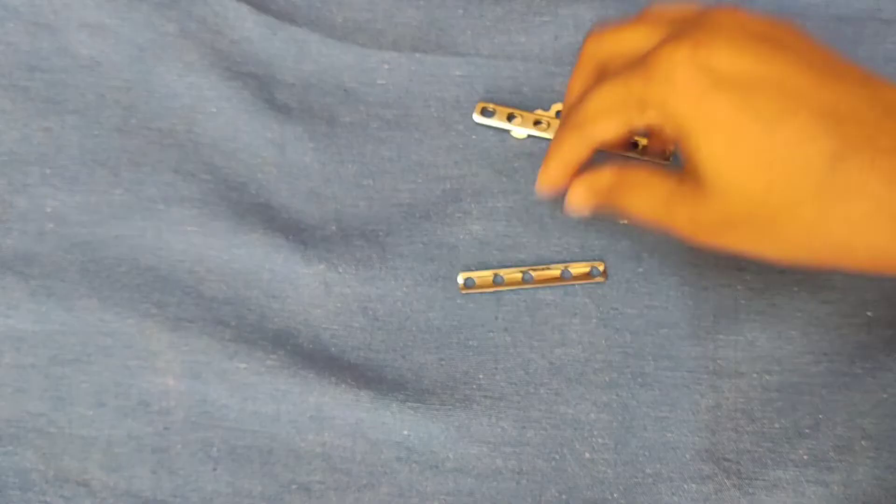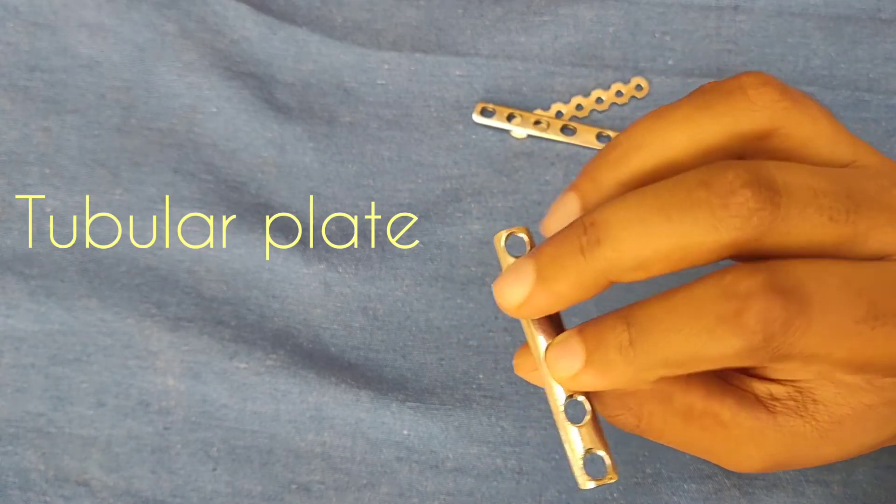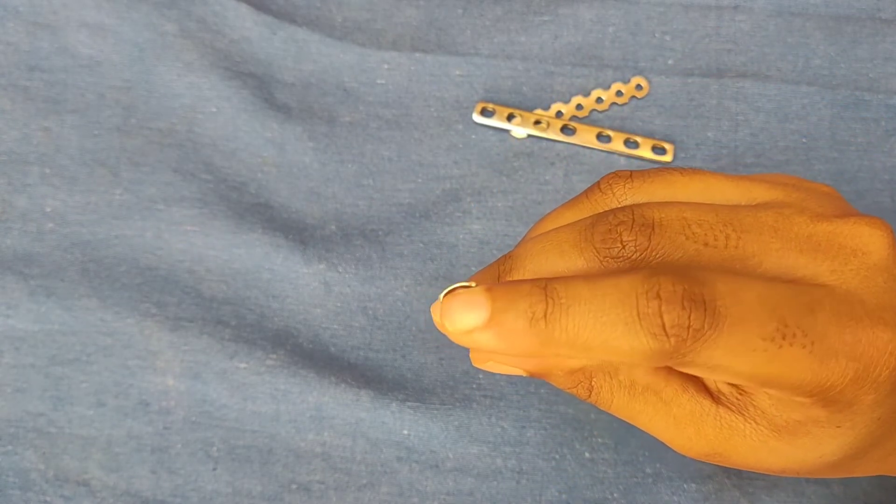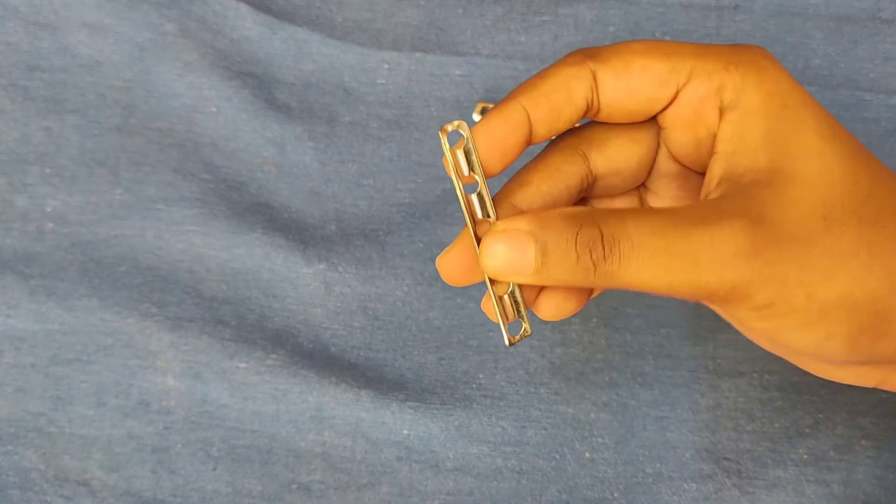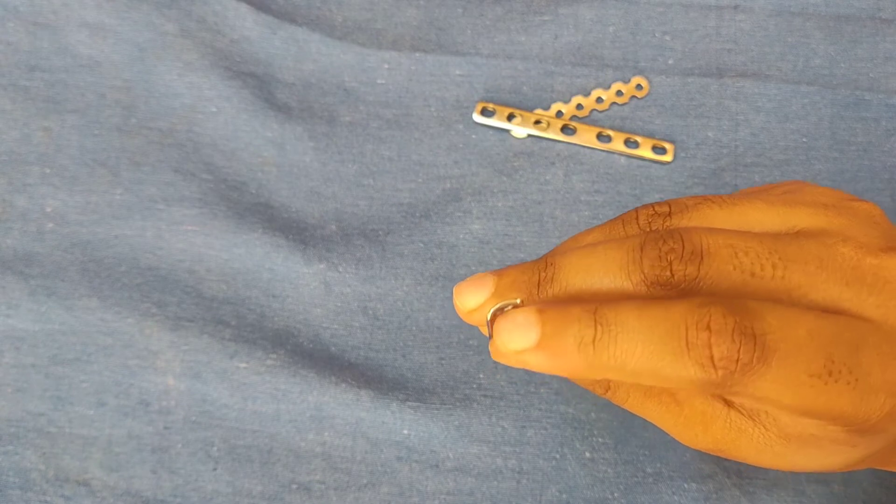Next is tubular plates. Tubular plates are actually part of a metallic cylindrical tube. It is mainly used in bridging and neutralization mode of plating. There are quarter tubular, one third tubular and semi tubular plates available.